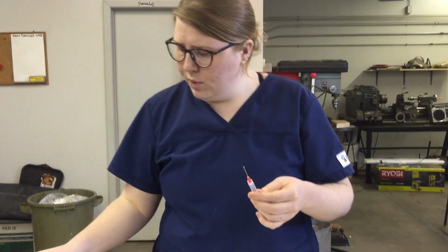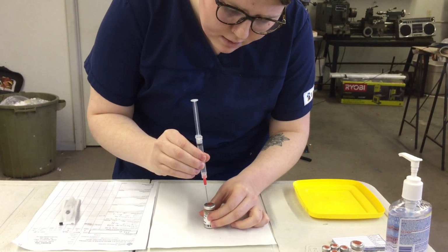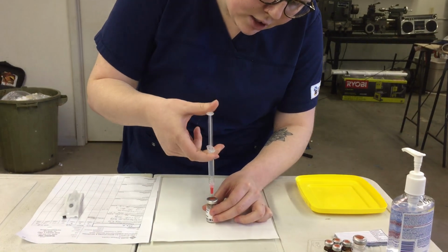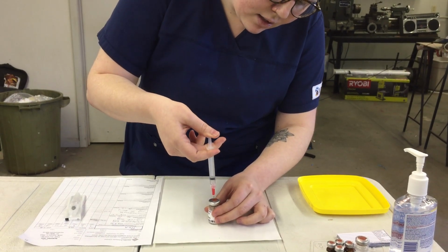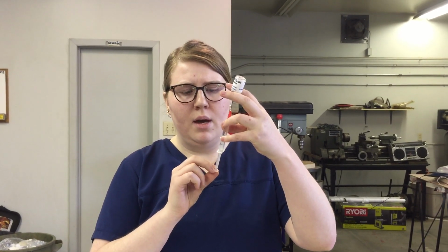Okay, so from here, I'm going to take the cap off and insert this into my vial. Okay, and I'm going to inject all of the air. So for demo purposes, this vial is not the best because it has been used so many times. So we're going to draw back 3 mLs, a little more than 3 mLs.